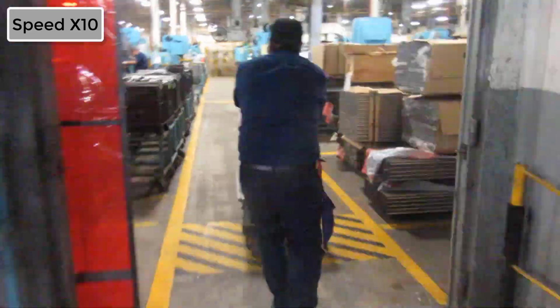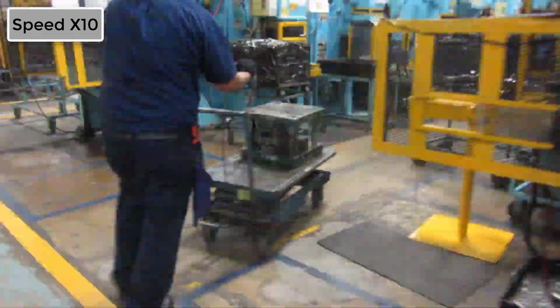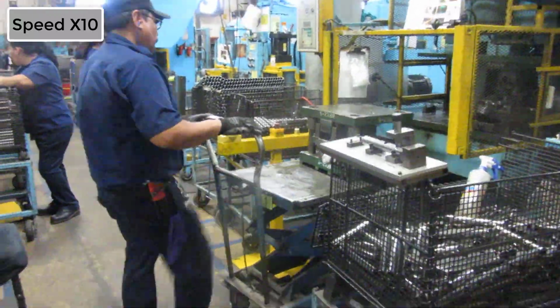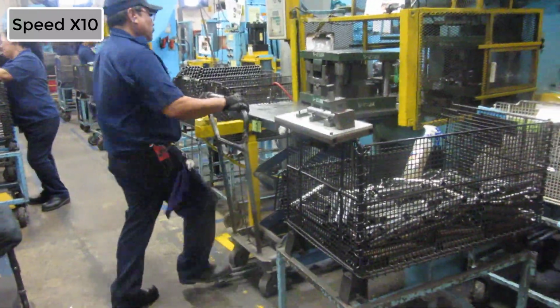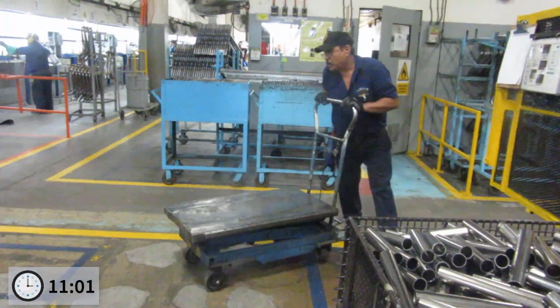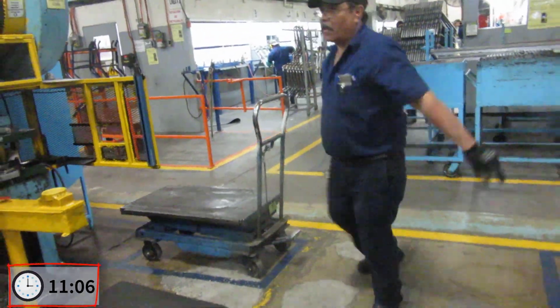Once he gets the new die, he has to come back to the press P46 and ask for someone to clean the bolster up. And repeat the same process of using the pedal to raise up the cart. And lastly, place the dice into the press machine. And this only includes the time for transportation, not installation time. Total transportation time 11 minutes and 7 seconds.